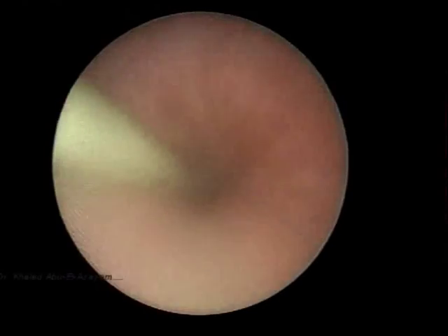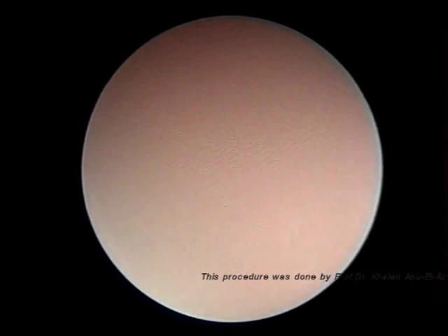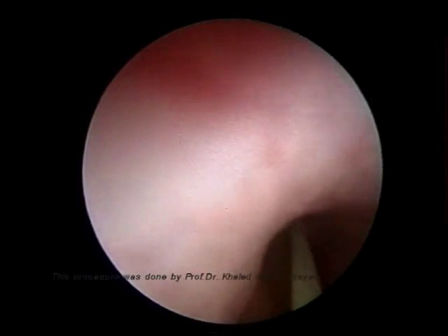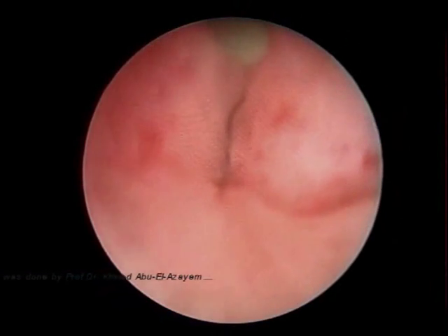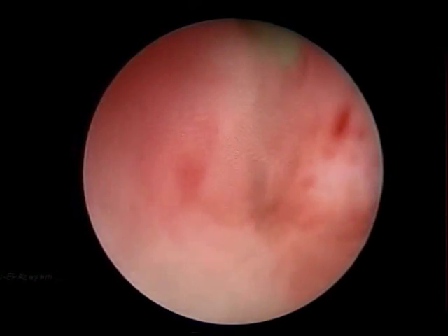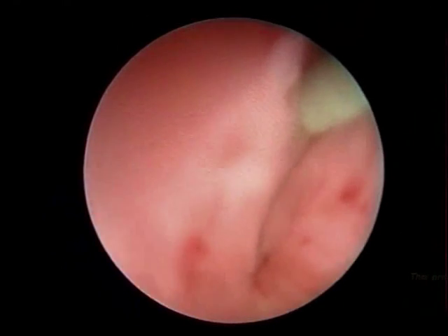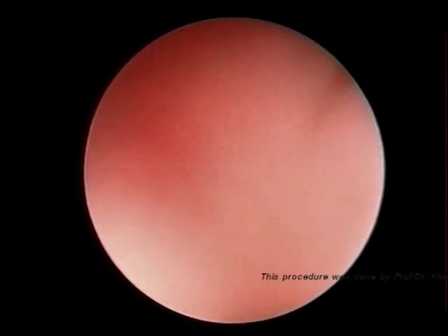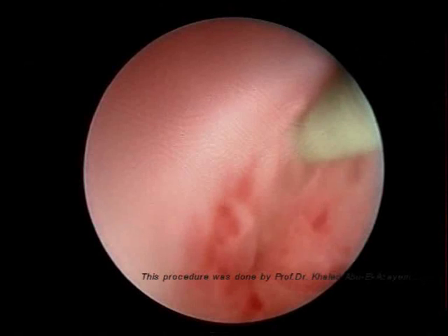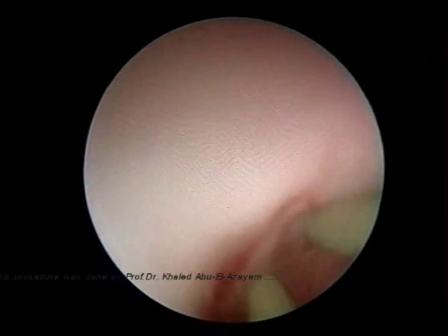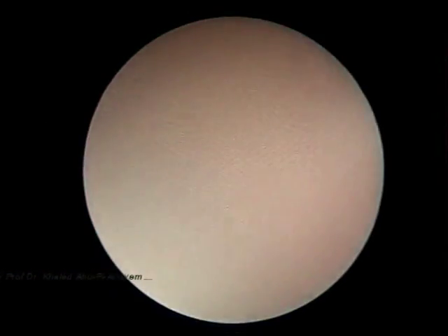This ureteroscope was eventually removed from the ureter and another smaller diameter ureteroscope was used. Now, using this smaller ureteroscope and guided with the guide wire inserted through the ureteroscope channel, we eventually bypassed the obstruction site to the renal pelvis.